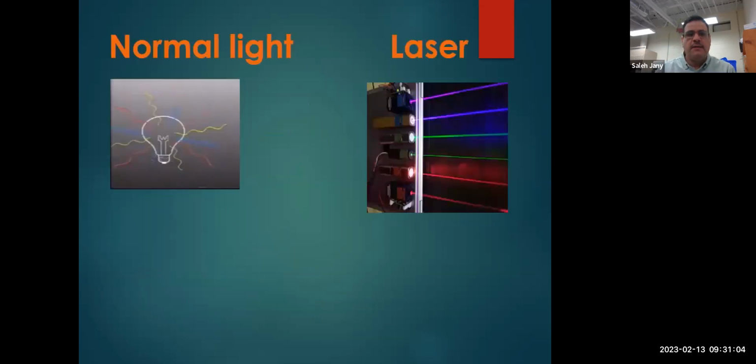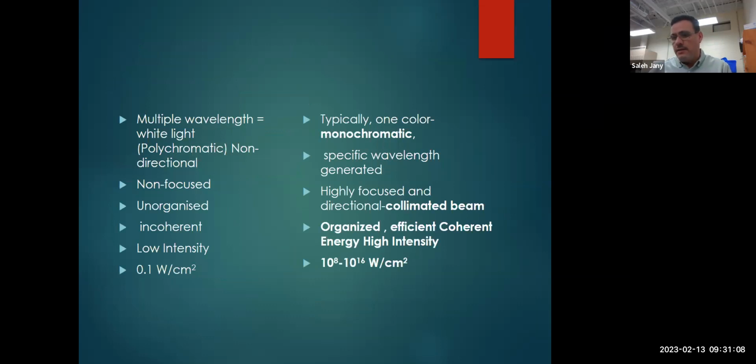And the difference between laser and light: normal light, let's see the light from the ceiling here, has different wavelengths.